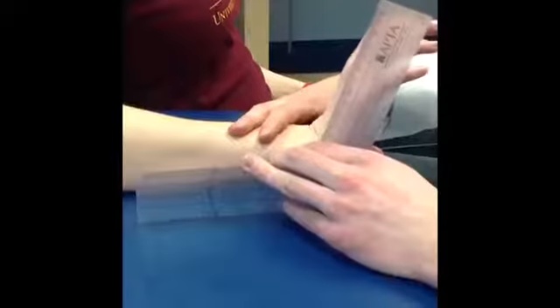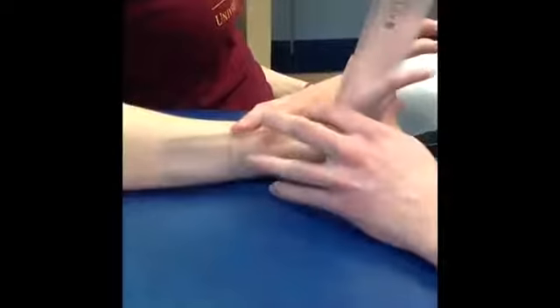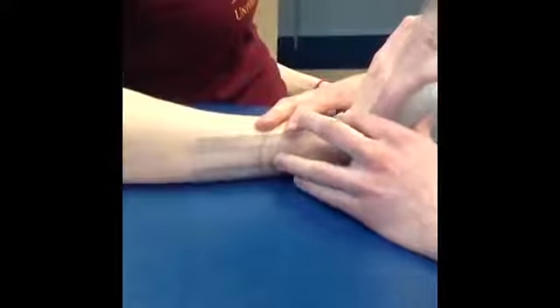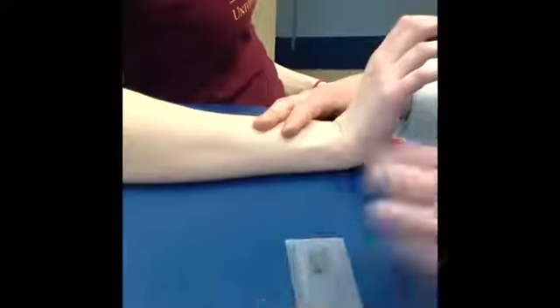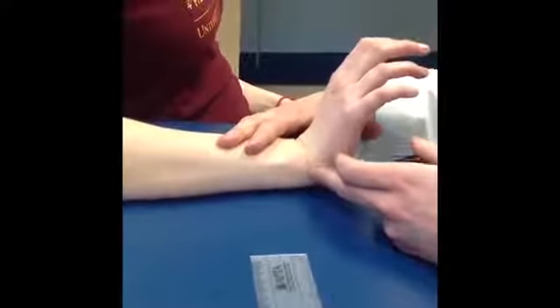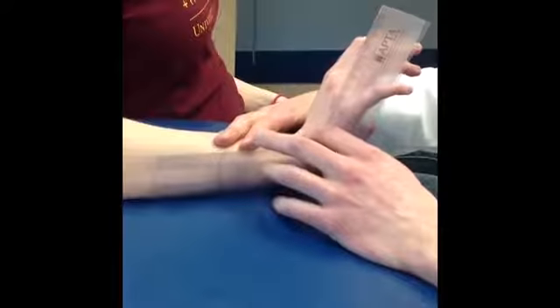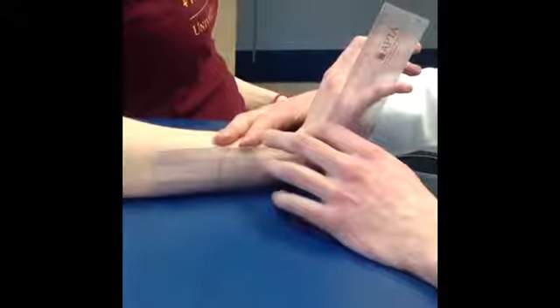One special note about this is don't just lay the goniometer down on the table. You need to still line it up with the shaft. It's going to be off by a few degrees if you didn't do that. And remember, 5 degrees is clinically significant on this test. So you're going to once again palpate for that triquetrum, just distal to the ulnar styloid process. You're going to come in and line up with the metacarpals.